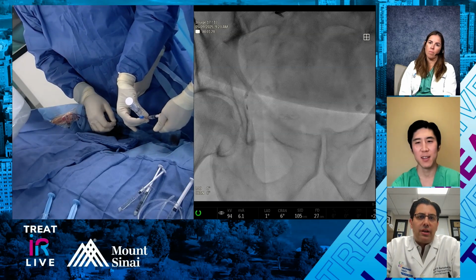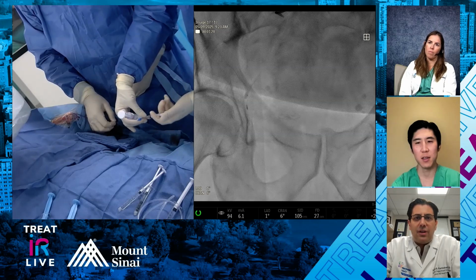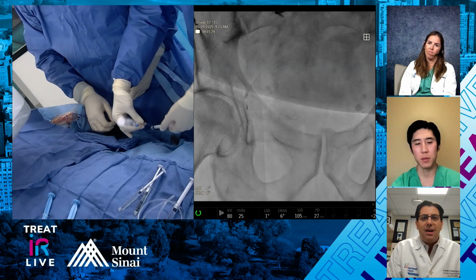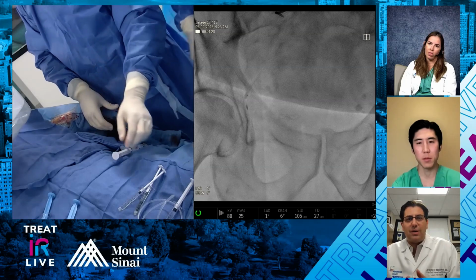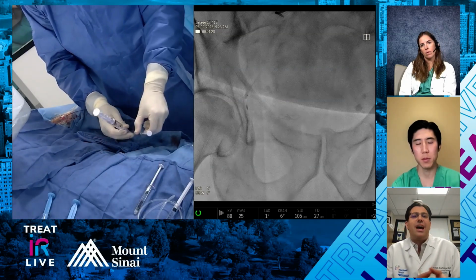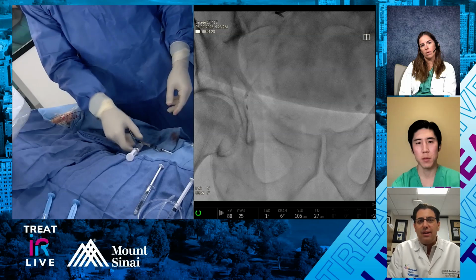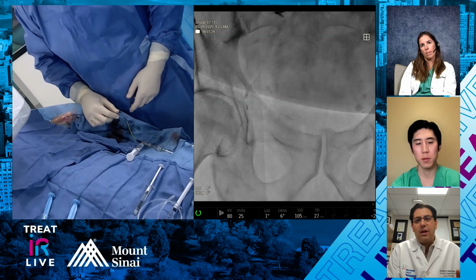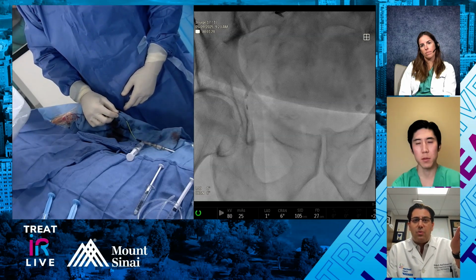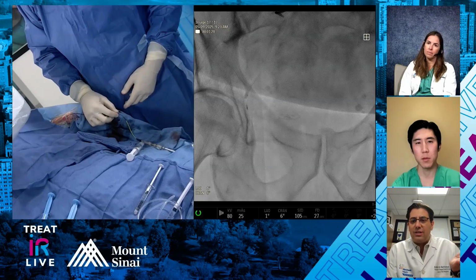1 to 10, you're looking at like 8%, a little bit of percent glue in the compound. Is it all Ethiodol? I'm using 1 to 6 currently, but sometimes my penetration's not as good. It depends on the vasculature. If I have a really atretic or narrow vascular I don't feel is going to take a lot of glue, I'll increase my dilution ratio to the 1 to 10, but I try to start at 1 to 6.